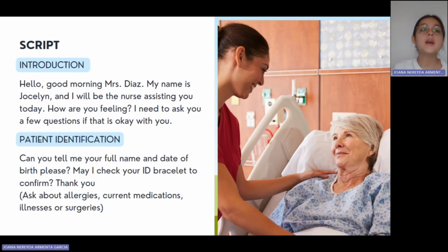How are you feeling? I need to ask a few questions if that's okay with you. We have then the patient identification. We have to identify our patient. We'll ask for the full name and date of birth of the patient. Can you tell me your full name and date of birth, please? May I check your ID bracelet to confirm this information?